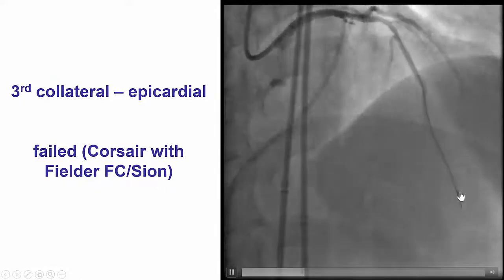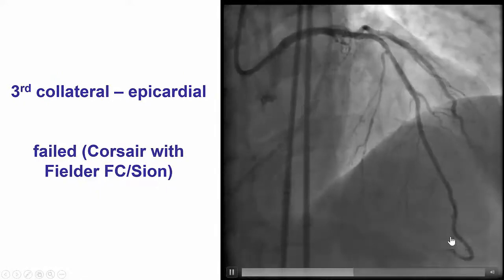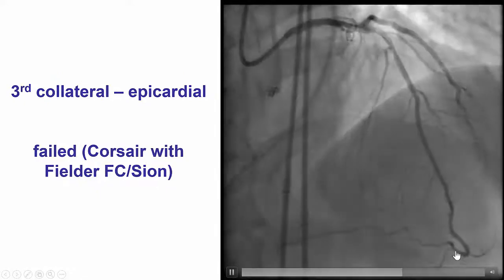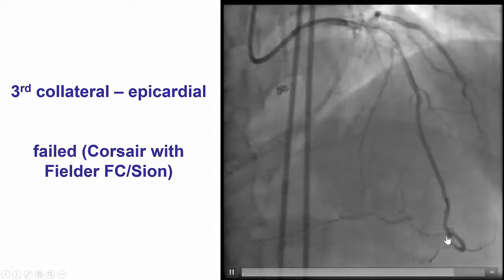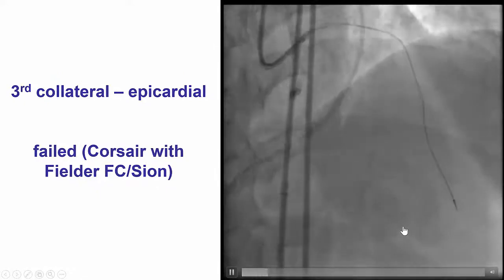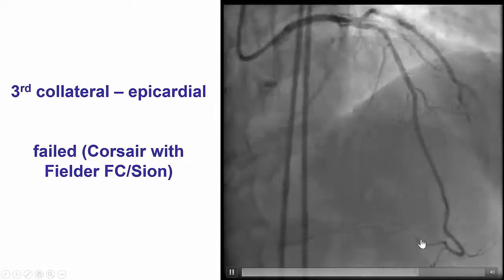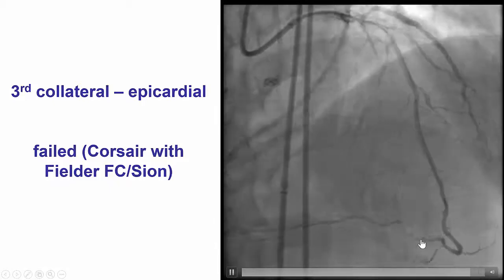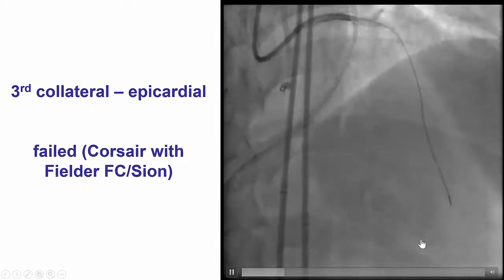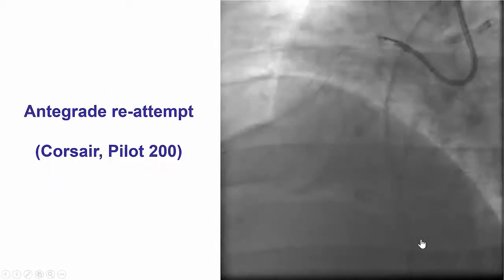We finally did attempt to cross through the epicardial collateral from the distal LAD. However, the wire would not cross past the area of tortuosity of the epicardial collateral.